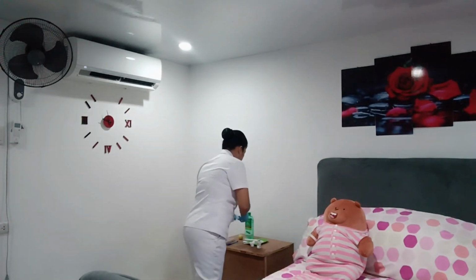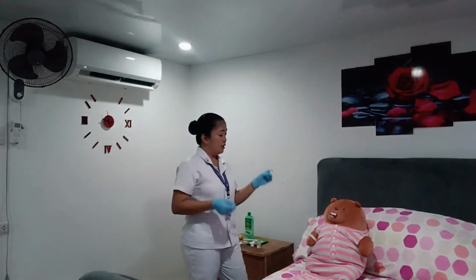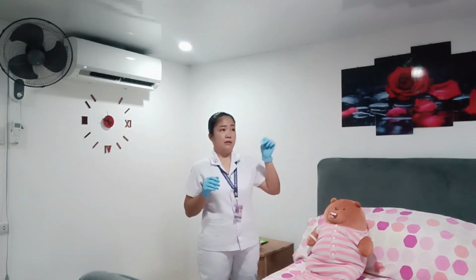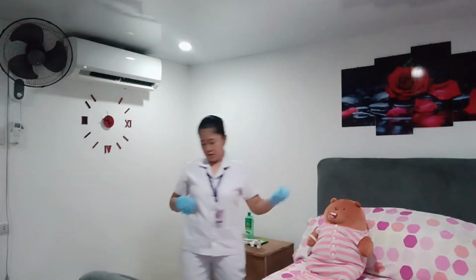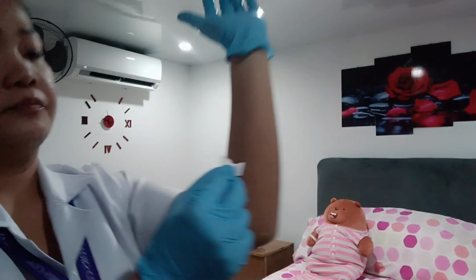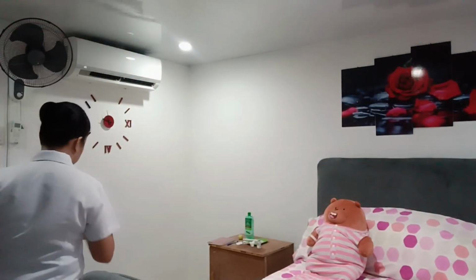Now I'm going to get my antiseptic pad to clean the area of the arm of my client. Again, do not rub it. Do the circular motion, like this one. Let me show you: from inside, going out. And then discard.